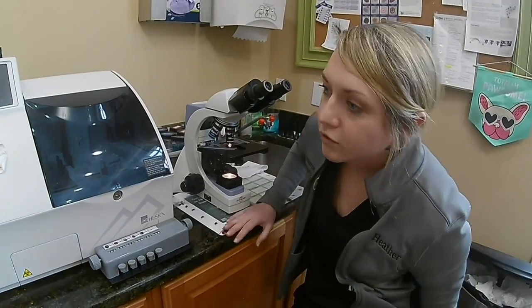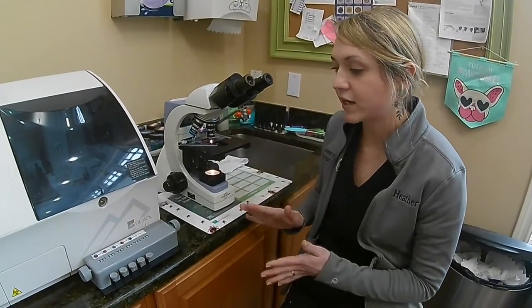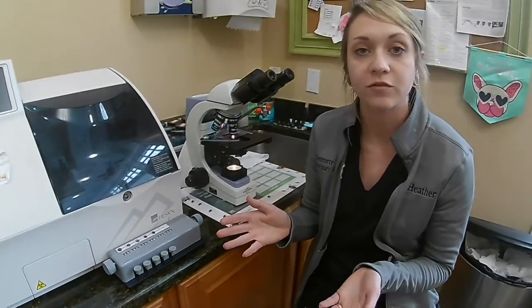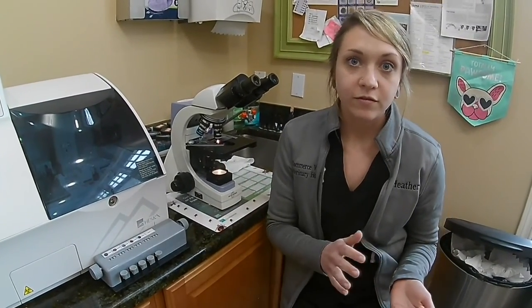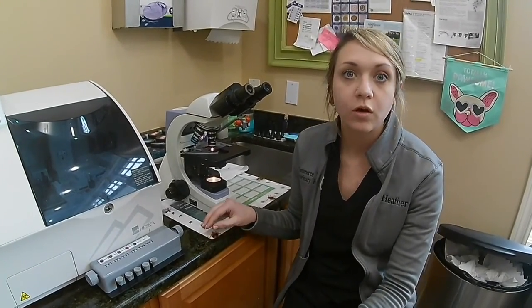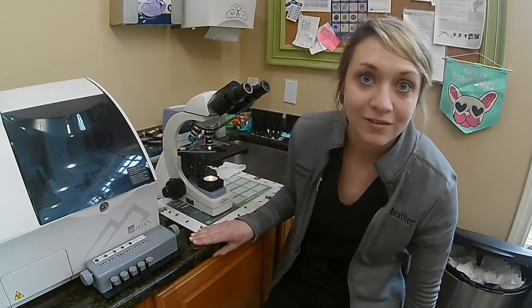Oh, also, before I forget, when you take that percentage that you get, like I said, if you count 70 neutrophils, you're going to get 70% of your sample is neutrophils. That is just your relative value. So to get an absolute value, what you would need to do is have your total white blood cells. You can get that number from using a hemocytometer.